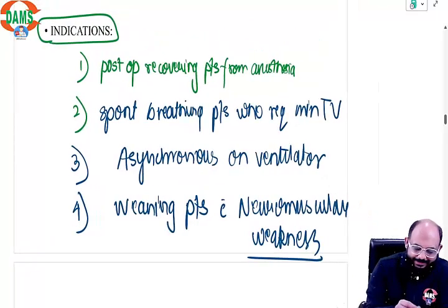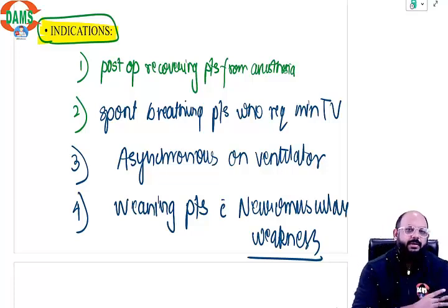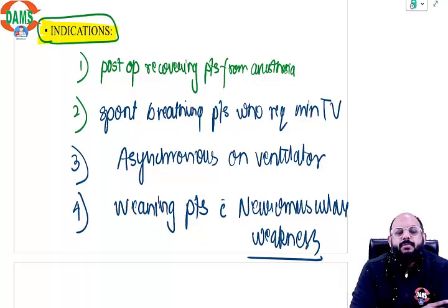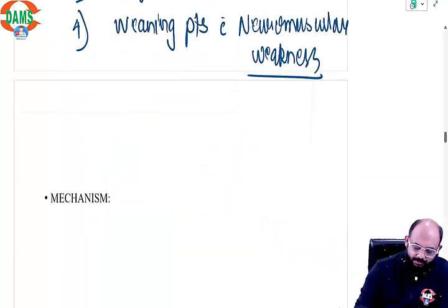So these are certain indications. So ultimately remember that if you are supporting volume, then it is important where there is some problem with the neuromuscular recovery, that is usually a post-operative patient or somebody with a neuromuscular weakness. Okay, with a neuromuscular weakness.